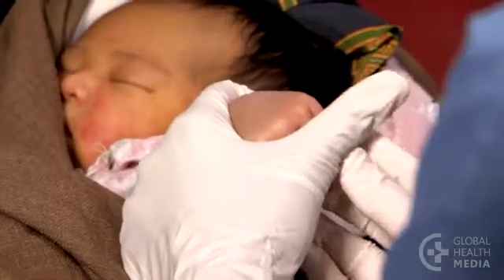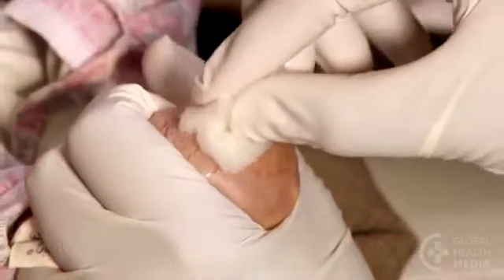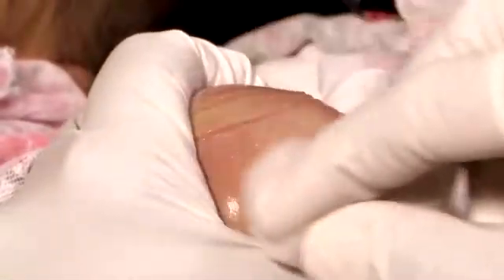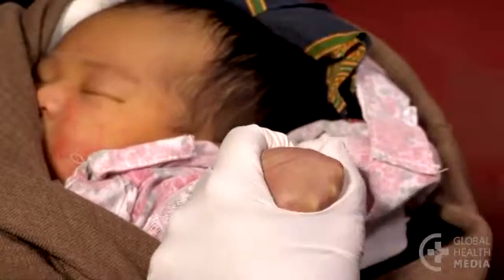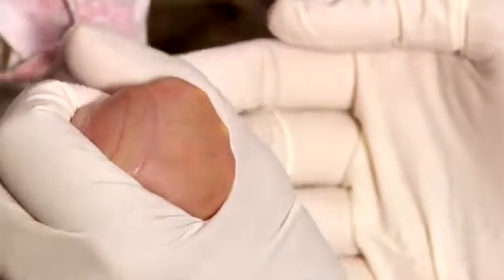Make a circle with your fingers around the baby's hand. Clean the skin from the center, moving outward. Do this 3 times. Let the skin dry. Stretch the skin and hold it firmly.